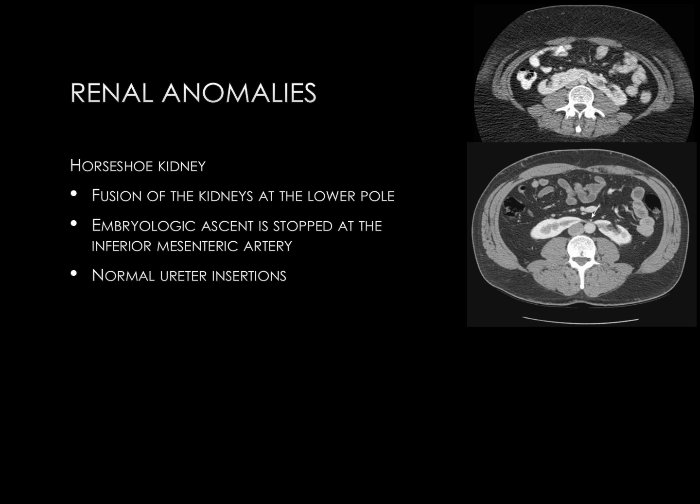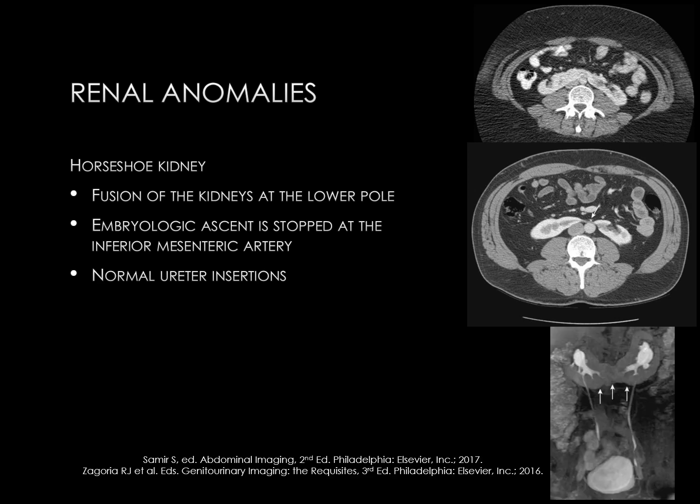Horseshoe kidney has normal ureteral insertions at the bladder. The right lower image is an excretory phase of an MR urogram, so contrast is within the renal collecting systems, ureters, and bladder. You can see that the lower pole of the renal parenchyma is fused in the midline, and the ureters are positioned in a normal location, both inserting at their respective portions of the bladder.